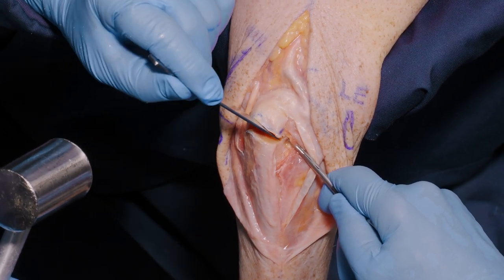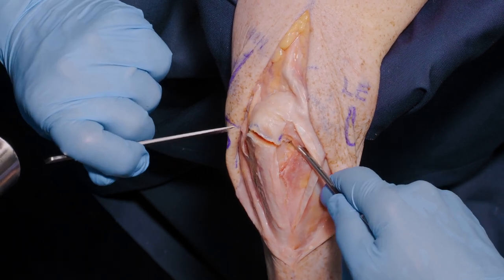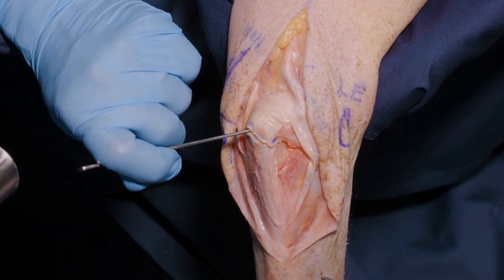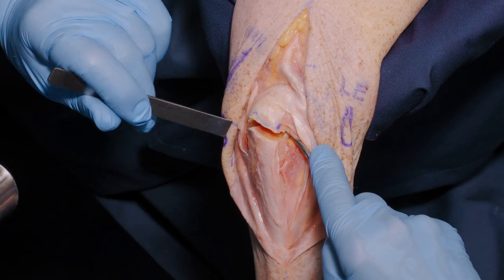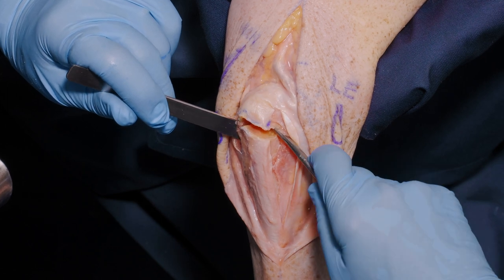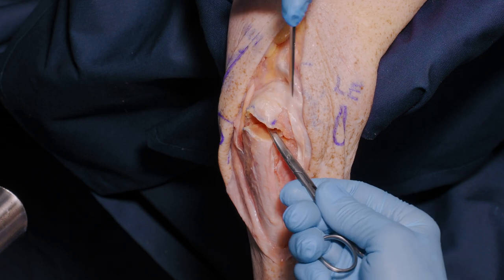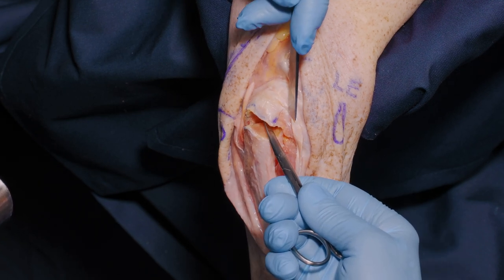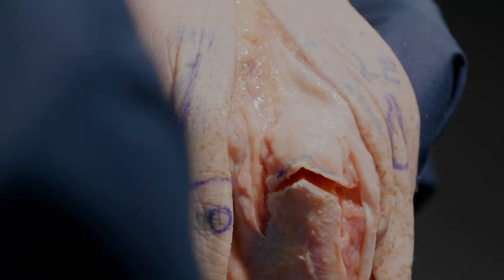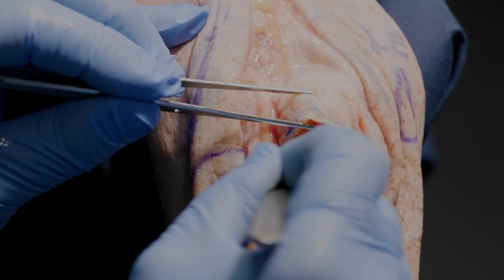What we're aiming for is a low energy, very controlled osteotomy, which is now held by periosteofascial tissue medially, free laterally, but in continuity with anconeus here. We'll free it up on the medial side.